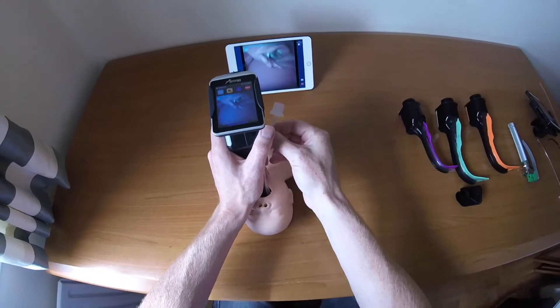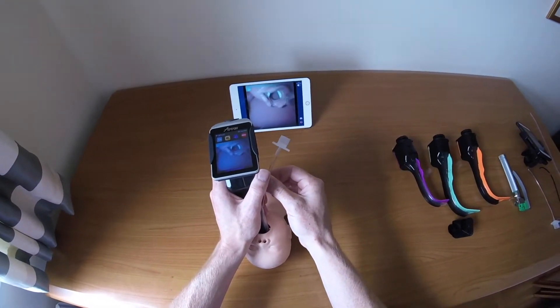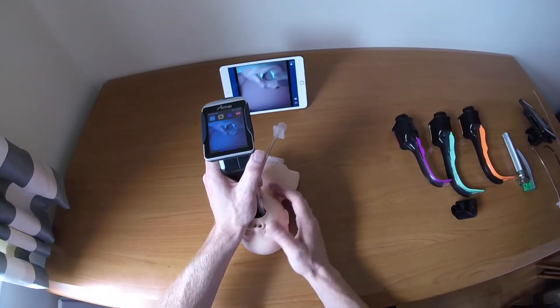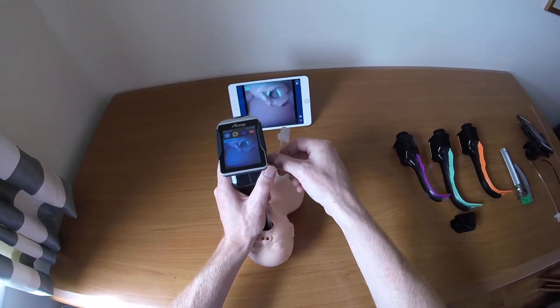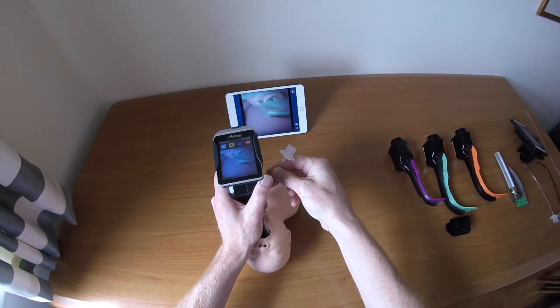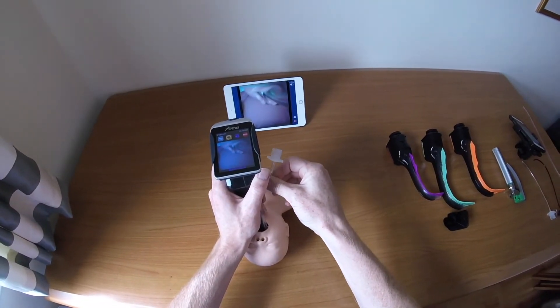A significant problem in small children is that bulky arytenoids can cause the tube to catch on the right arytenoid. The main way to avoid this is to aim for the left side of the airway — make an anti-clockwise movement as you advance initially so the tube goes left, then once past the right arytenoid make a clockwise movement into the airway.